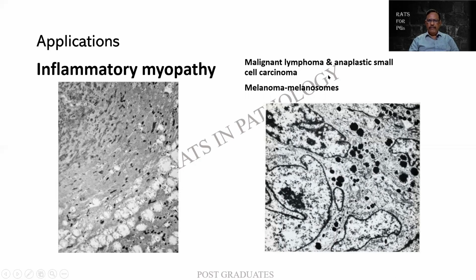Sometimes it is difficult to diagnose the various small tumors or the anaplastic tumors. This is a case of a melanoma in which the melanosomes have been picked up by the electron microscope.